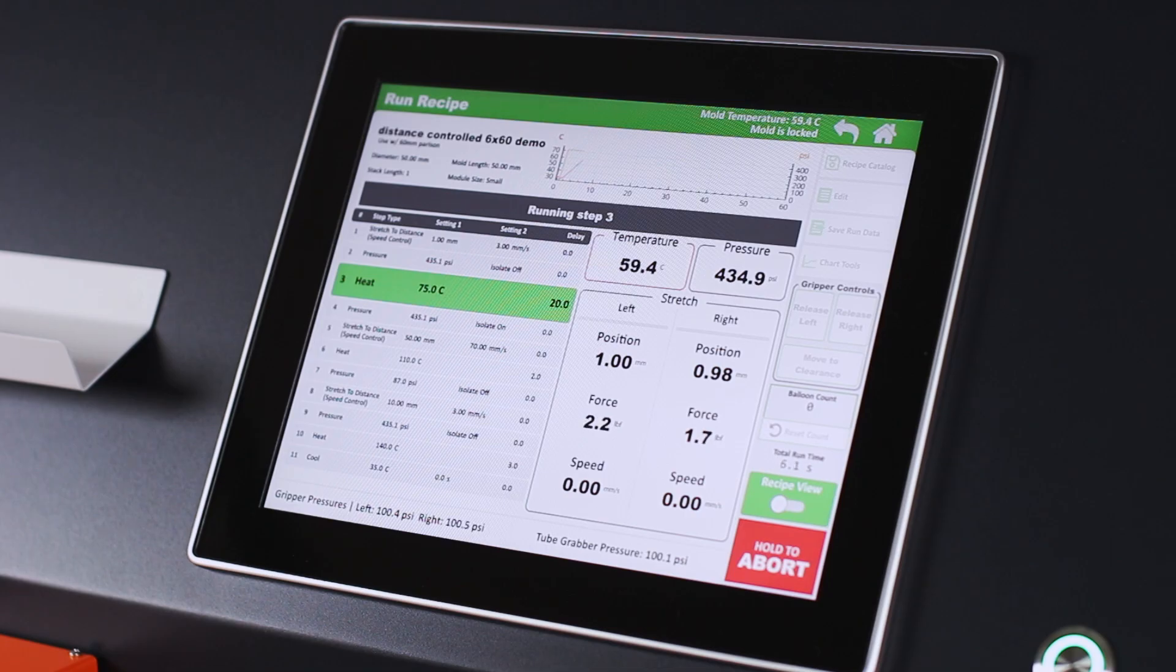During the cycle, all process data is output on the run screen, including mold temperature and balloon pressure, as well as left and right gripper position and force.